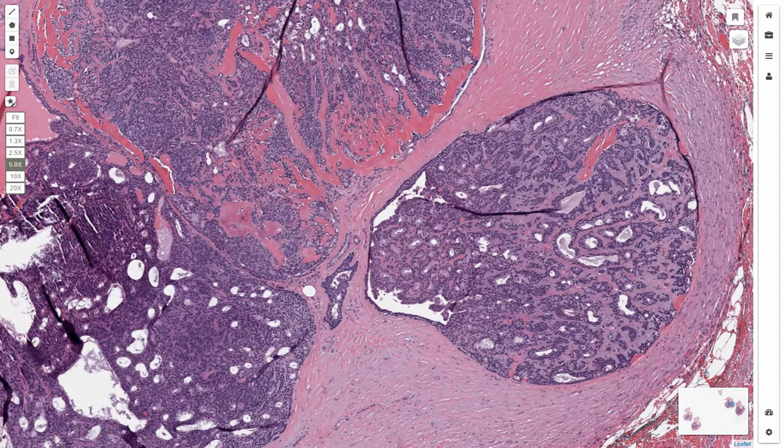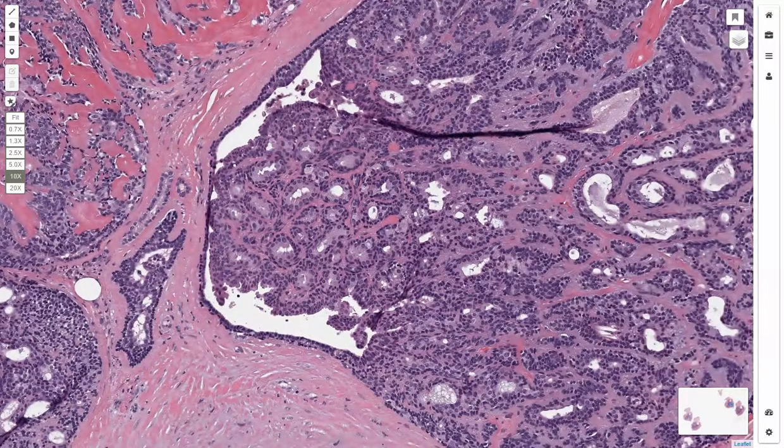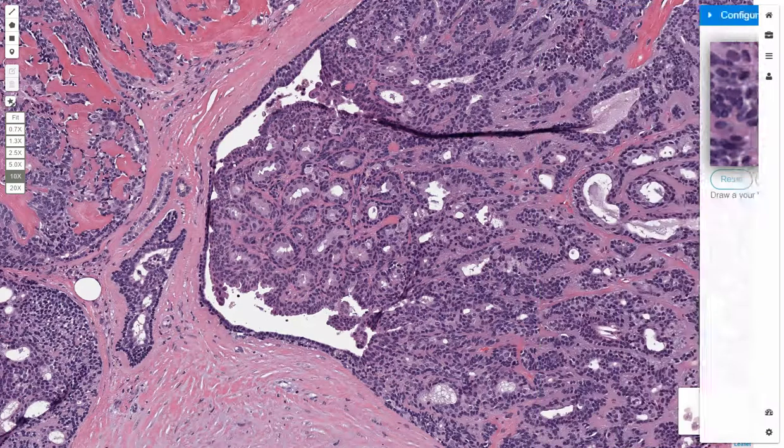morphologic features within any given histologic section without the need for extensive training, and often, not always, but often, it is possible to converge on a characteristic morphology with as few as a single vector, which is really a significant departure from what is encountered with traditional machine learning or deep learning techniques that require larger curated sets of entire classes of images. So in this example, here I'll just pick some adjacent nuclei of this epithelial tumor.